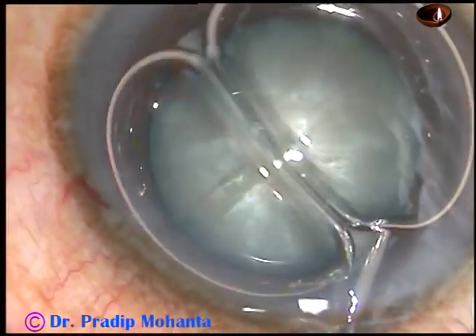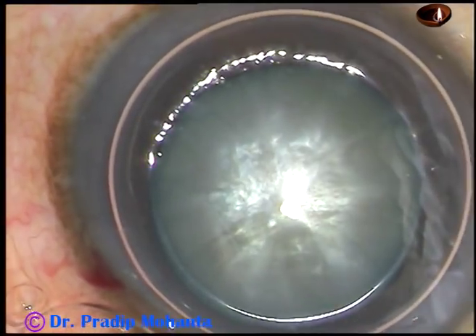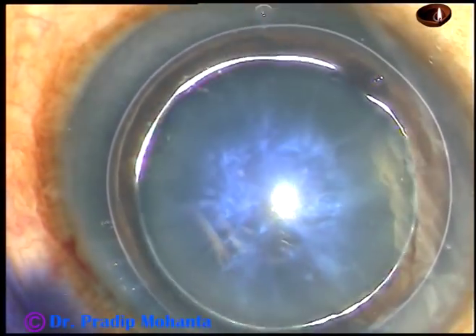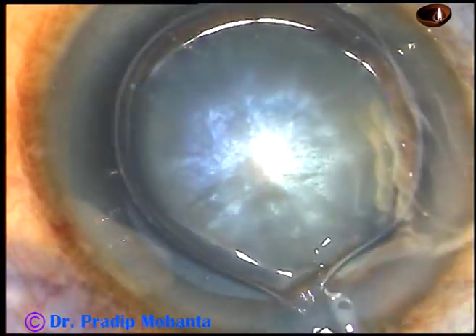So after the incisions, inject an air bubble and now inject trypan blue dye to stain the anterior capsule of this white cataract. It will create contrast and you'll be able to do capsulorrhexis very easily.